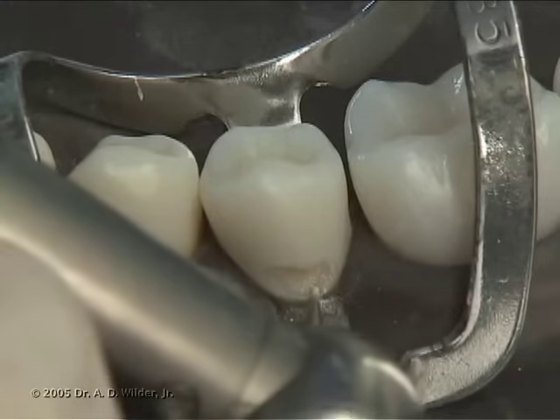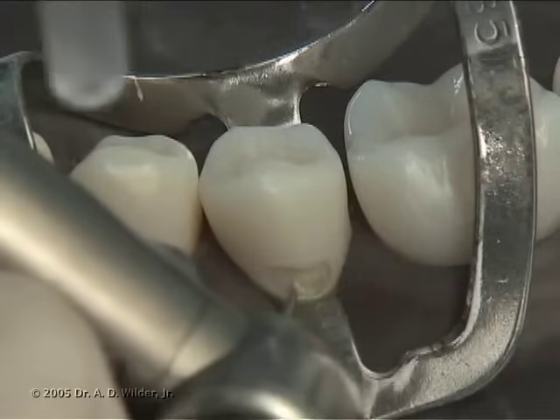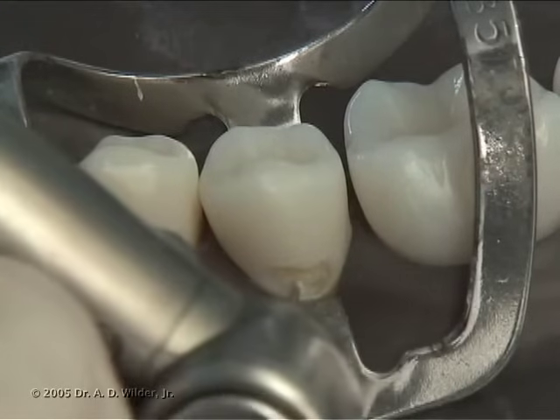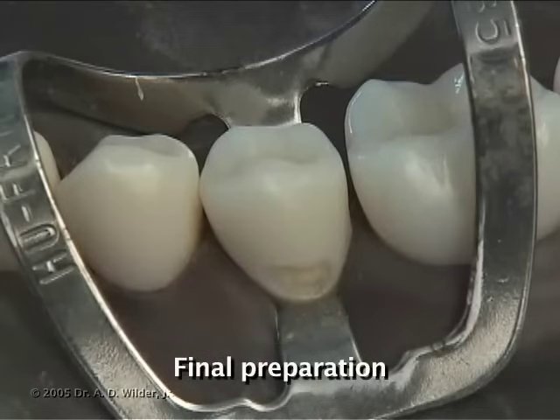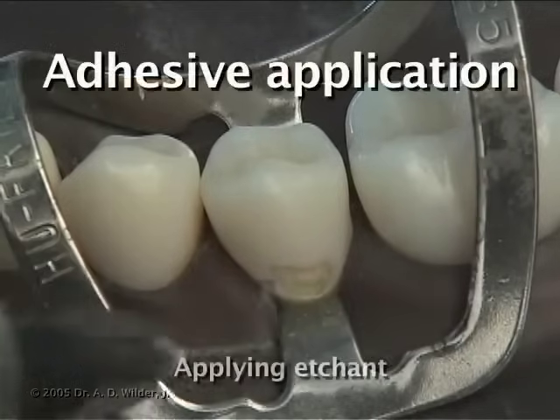As always, retention grooves are placed just inside the dentin enamel junction with a depth of 0.25mm, half the diameter of the quarter round burr. No matrix is necessary here.